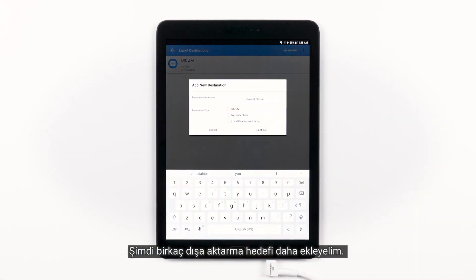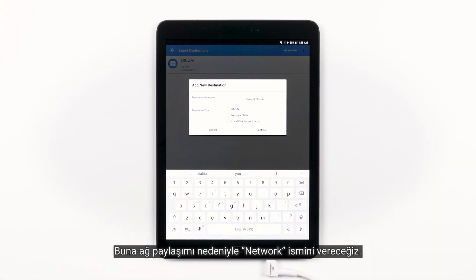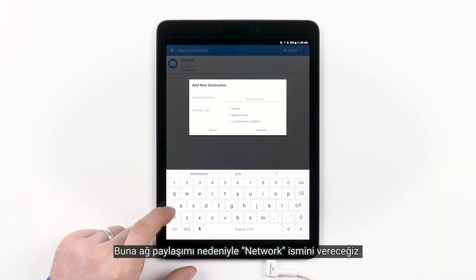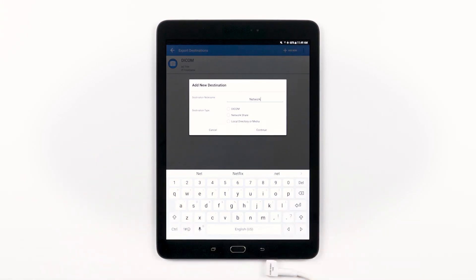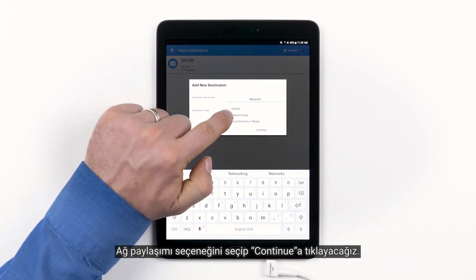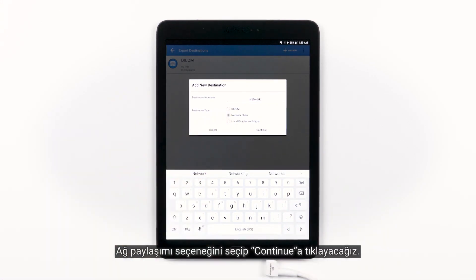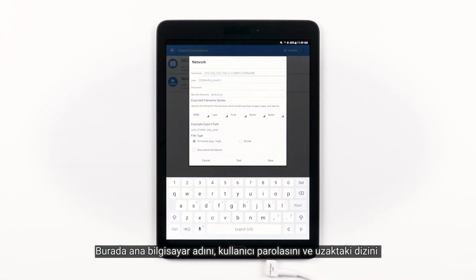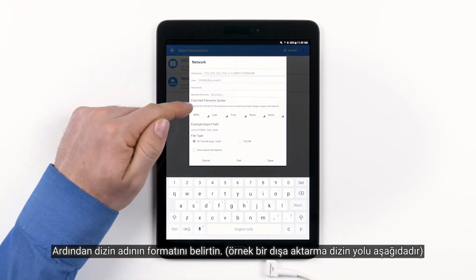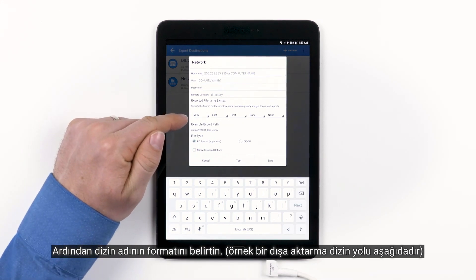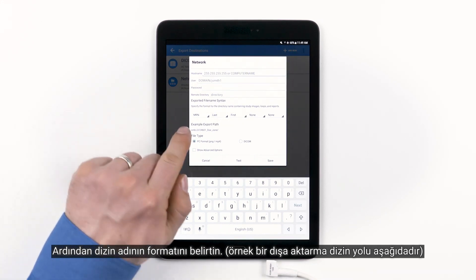So let's add some more export destinations. We're going to name this one Network for Network Share. We'll choose the Network Share option and then tap Continue. Here you'll type in your hostname, user password, and remote directory. Again, you may need to work with IT or your network admin to fill this out correctly. Then specify the format for the directory name — you will see an example export path below.